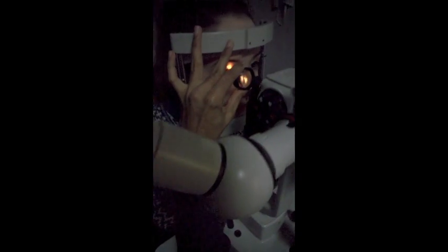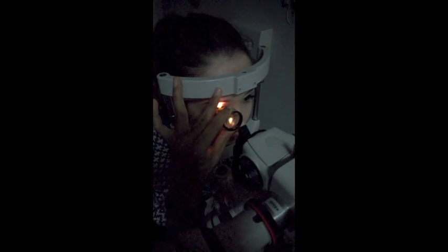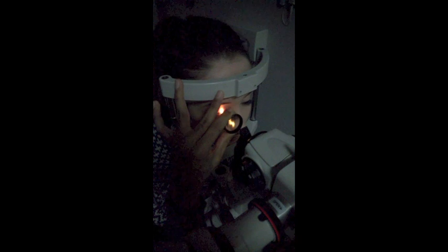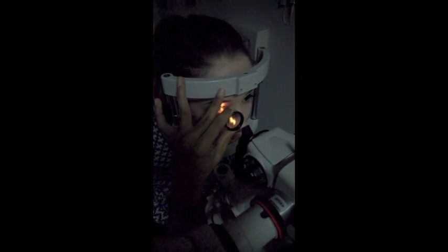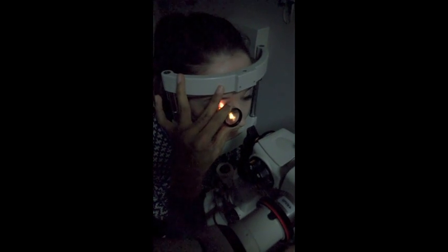Hold the lens by the thumb and forefinger at its working distance. This will be around 1 cm from the cornea. You should try to avoid touching the patient's eyelashes. To steady yourself, rest the other fingers on the patient's forehead or the forehead rest of the slit lamp. To get your hand into position, you can rest your elbow on the lens case if needed.